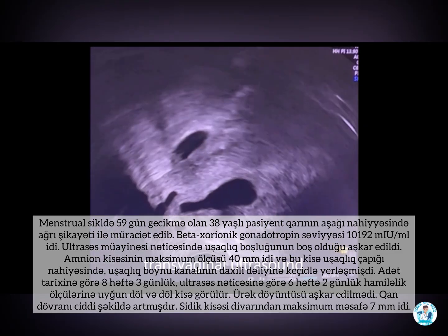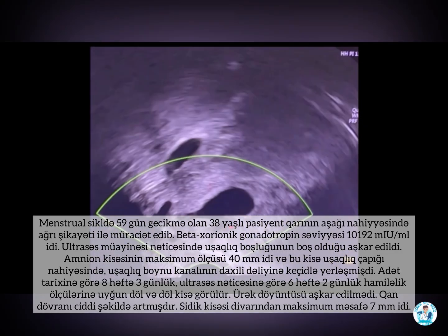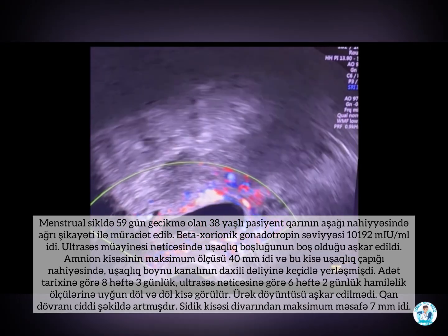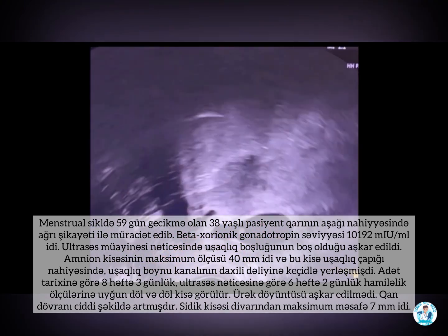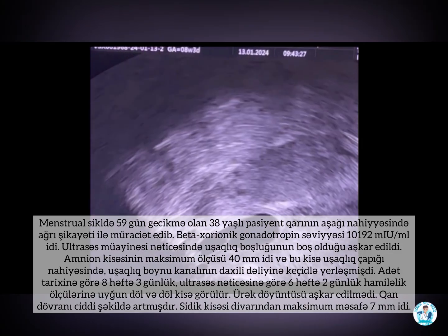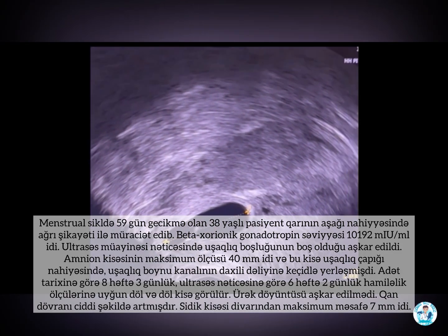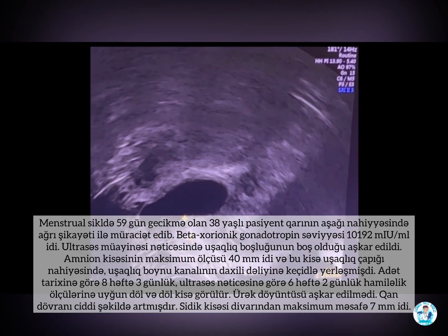10,192. Transvaginal ultrasound: the endometrium is thickened. There is no fertilized egg in the uterine cavity. In the area of the scar on the uterus with the transition to the internal os and upper third of the cervical canal, a fertilized egg is detected. Vascularization around is greatly enhanced. The thickness in the area of the scar to the bladder wall is 7 millimeters.